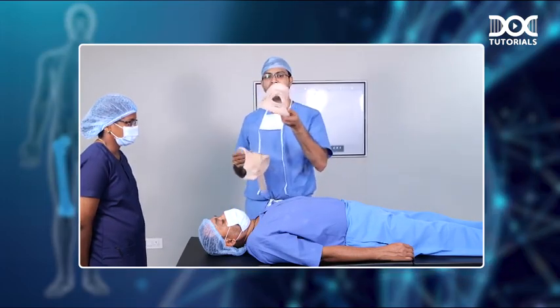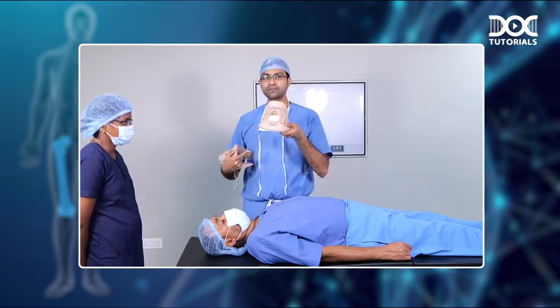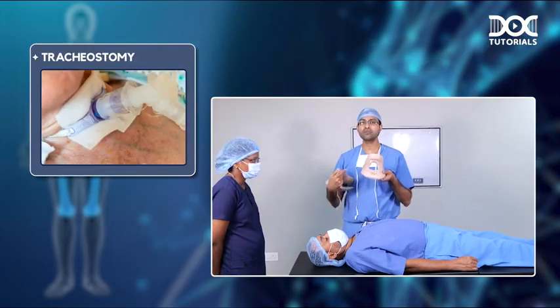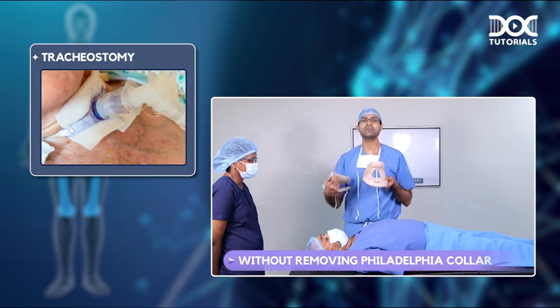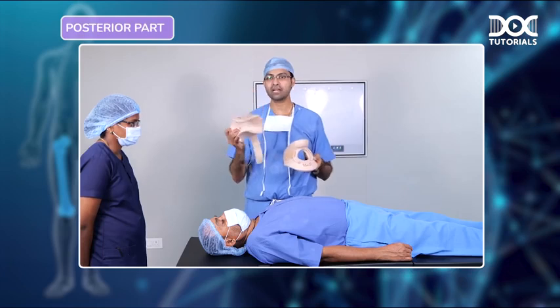An anterior part with a hollow in the front like this. And what is the use of this hollow or a hole? This is for tracheostomy. If you want to do a tracheostomy for the patient, you can do it without removing the Philadelphia collar. That is the advantage of Philadelphia collar. And then you have the posterior part like this.